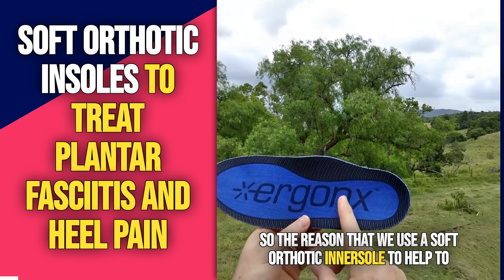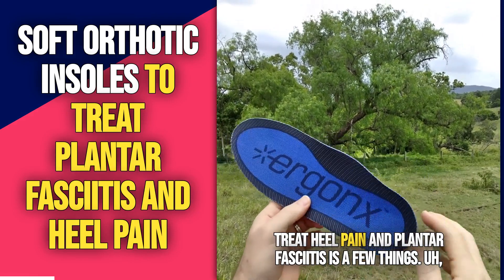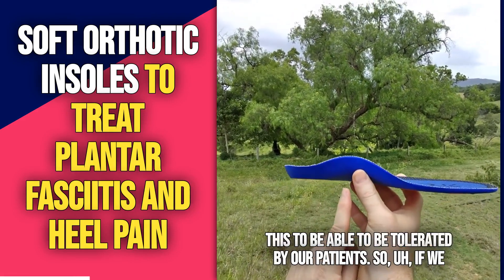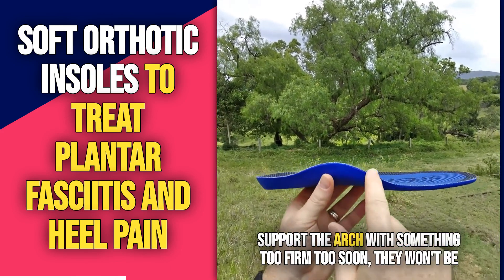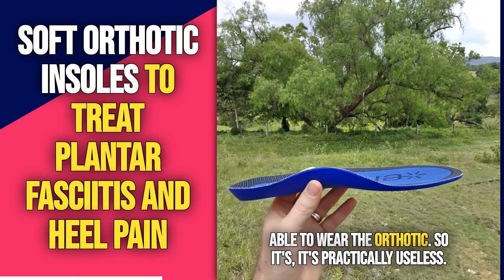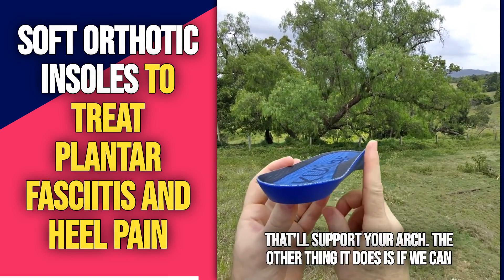The reason we use a soft orthotic inner sole to help treat heel pain and plantar fasciitis comes down to a few things. If we use an arch support orthotic inner sole, we want it to be tolerated by our patients. If we support the arch with something too firm too soon, they won't be able to wear the orthotic, so it's practically useless. So we use something that's nice and soft to start with, and that'll support your arch.